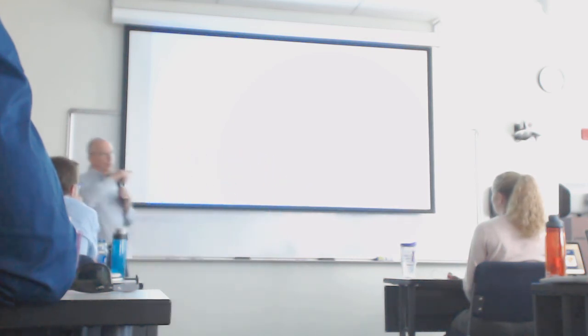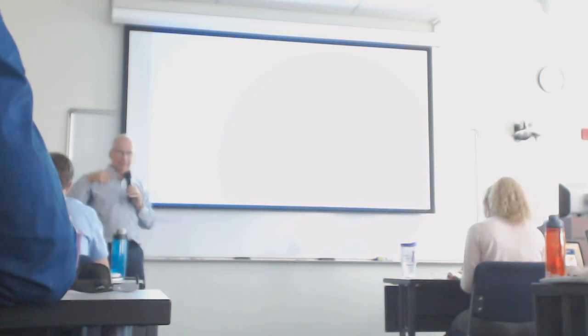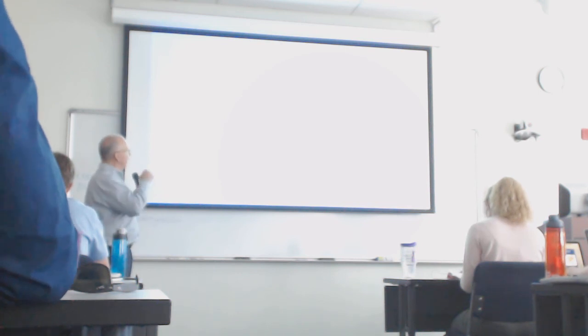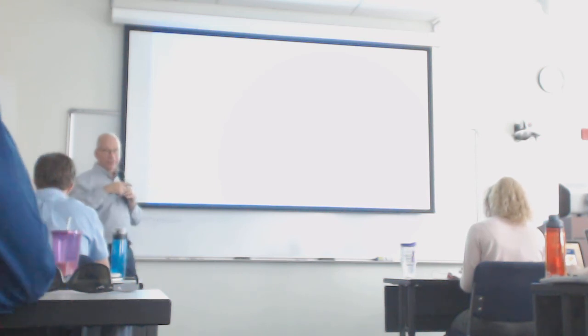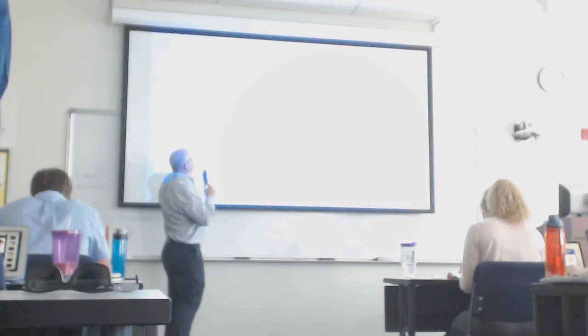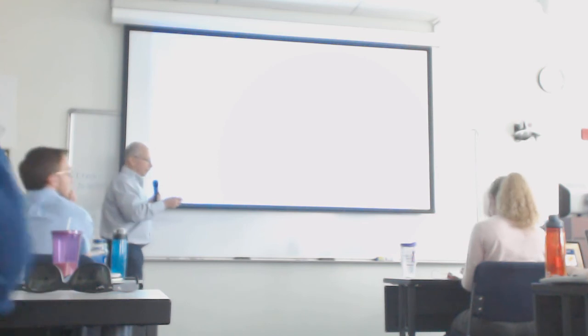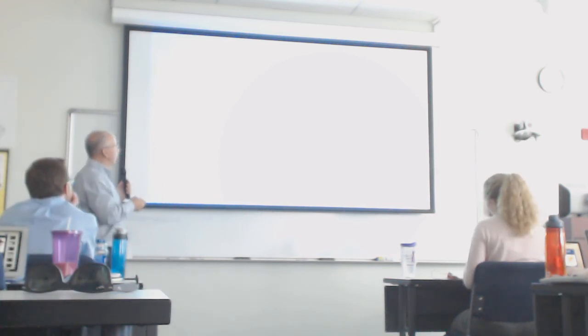This happens to be the area where the highest degree of cervical spine congenital anomalies is, at C1, C2. It's also a place where you don't want to miss any fractures because there's some serious anatomy traversing here, right? The proximal spinal cord, very, very important real estate.